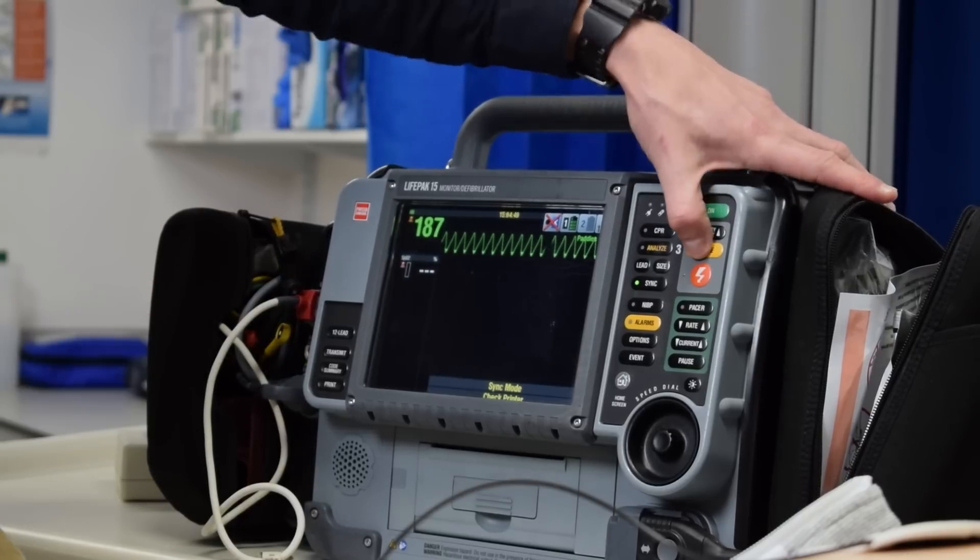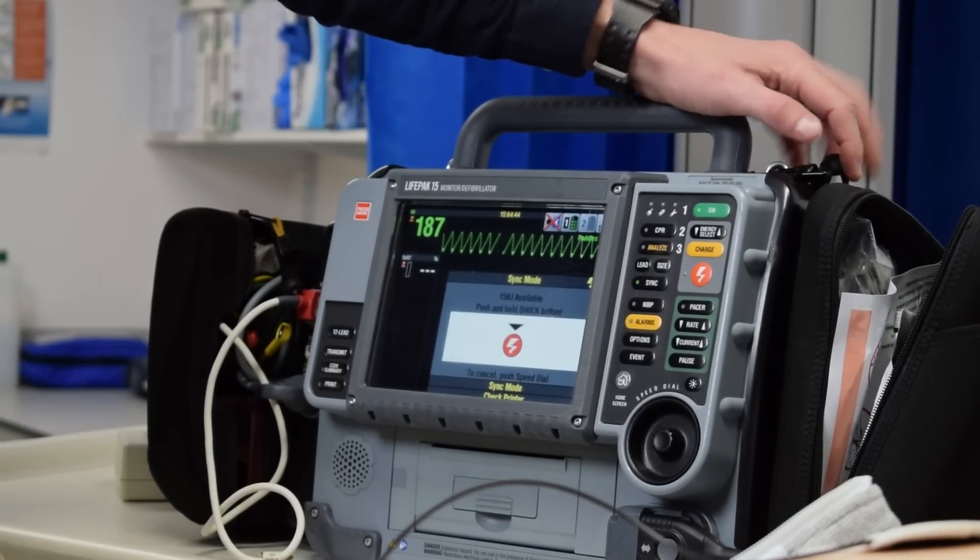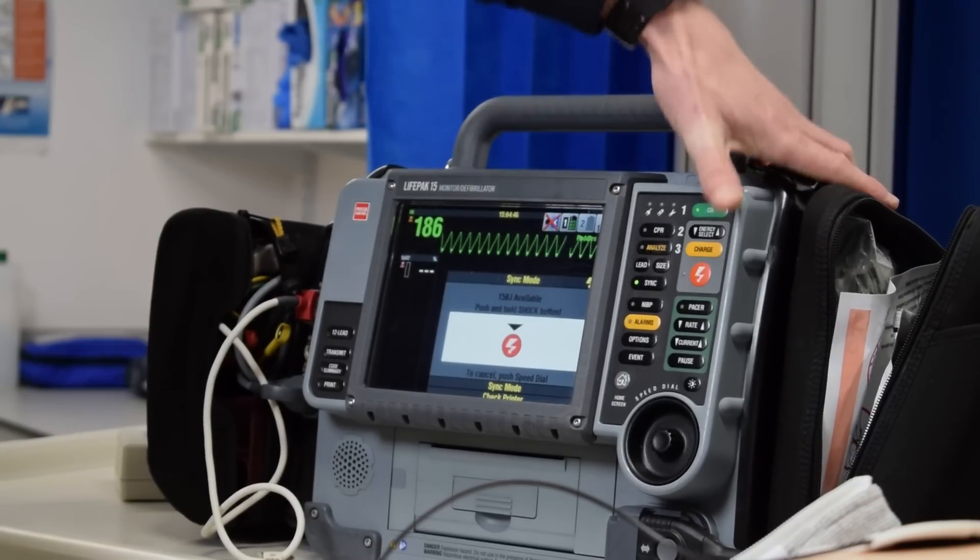We need to make sure we're on sync and shock again. Let's jump to 150 joules. We're going to charge again and shock — remember, hold down the shock button.